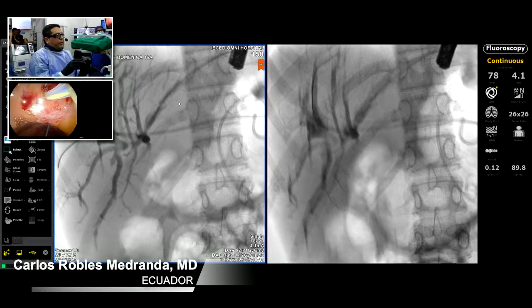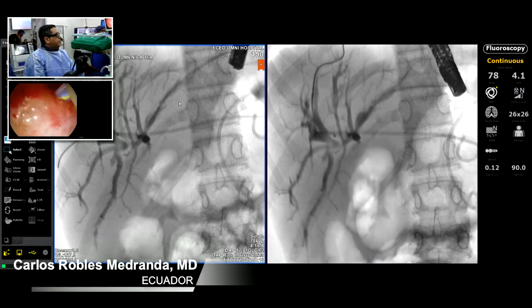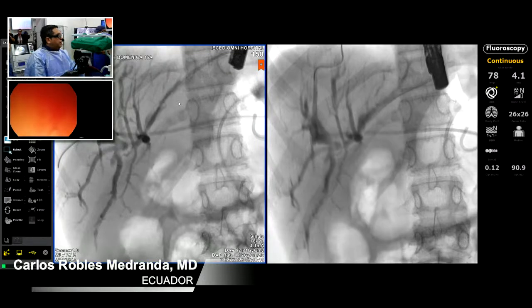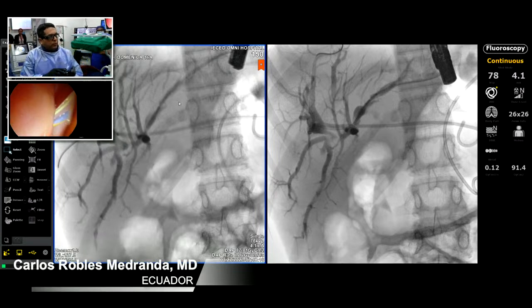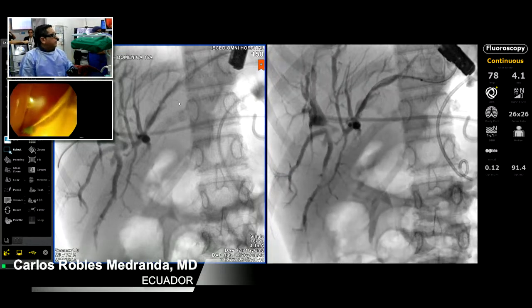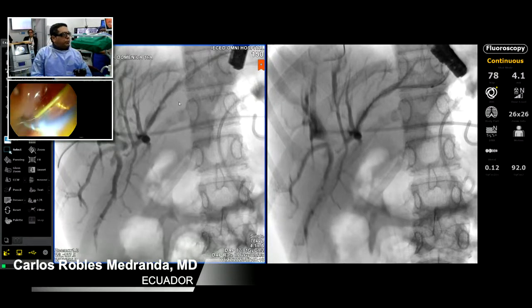Maybe. You see where is my other stent? Ok, empuja bien, ¿no? Quiero la pinza del cuerpo extraño. Empuja bien. Sabes que dilatemos. So what I will do also is to perform a balloon dilation before that tricky situation. Just to be sure. Empuja. What? No, balloon dilation. I will pass a balloon, I will dilate, and I will remove the stent, and then I will put just one stent.